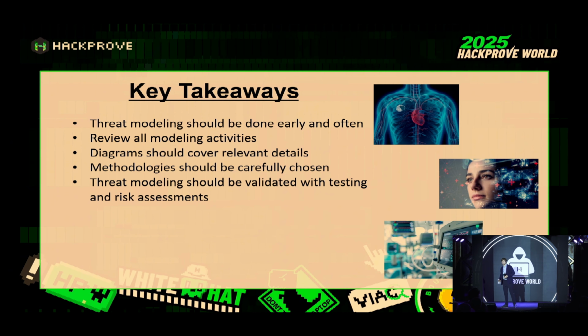All right, we want to look at some of the main points of this. And I know I've probably said it 4 times already, but threat modeling should be done early and often. And this applies not only to a device manufacturer or a consultant, but bug bounty hunters and application penetration testers. You guys are going to have a lot more success if you try to step back and think about what can we do to hurt this, how can we beat up this application before we actually get into the application.